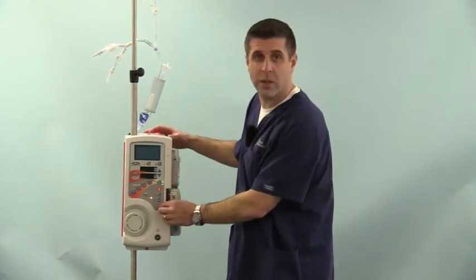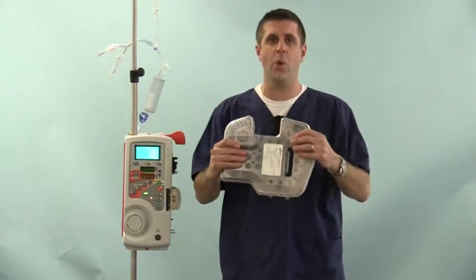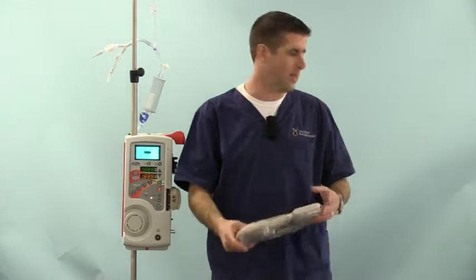The ThermaCor 1200 is the easiest rapid infuser to set up on the market, bar none. Let's walk through a quick setup of the unit. I'm going to go ahead and power on the unit and remove the component guard. This guard should always be on the unit when it doesn't have a cassette.